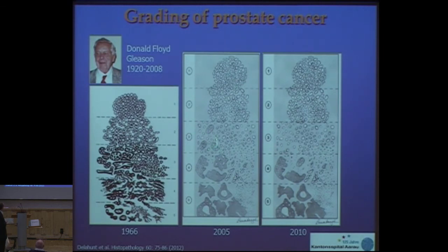You see this one here, which was also acknowledged as Gleason pattern 3, that was taken out, and that one dropped here. See, this one taken out, and they dropped it just here. So the message here is the community is taught, don't do a low grading, become high graders, and that is what we see now, and I'll get back to this in a minute.